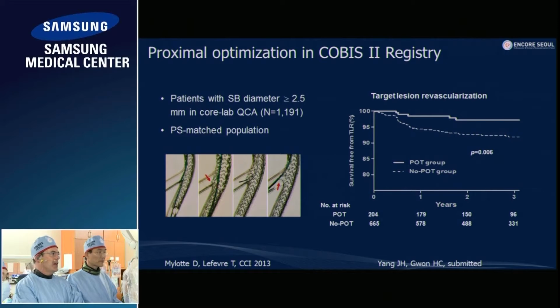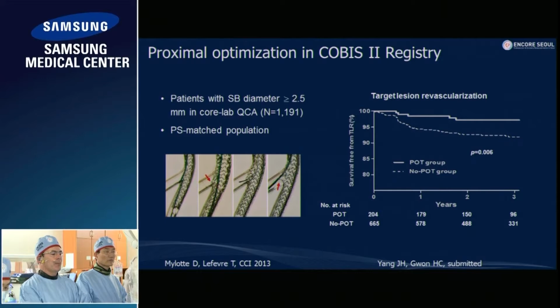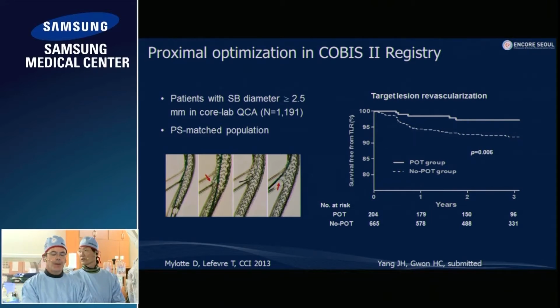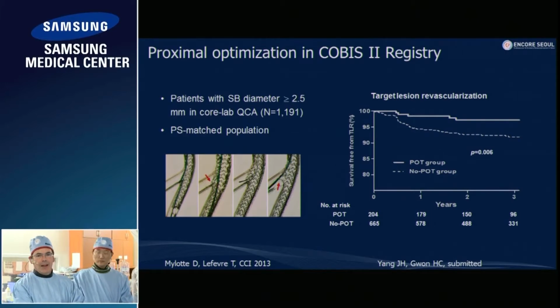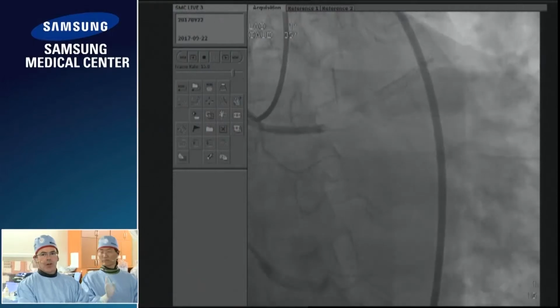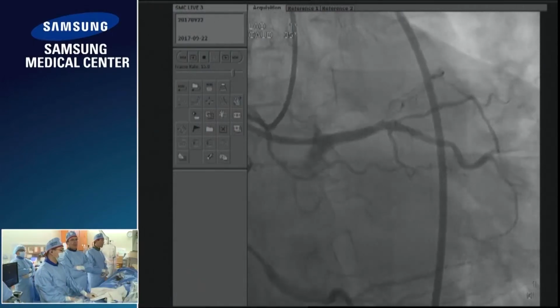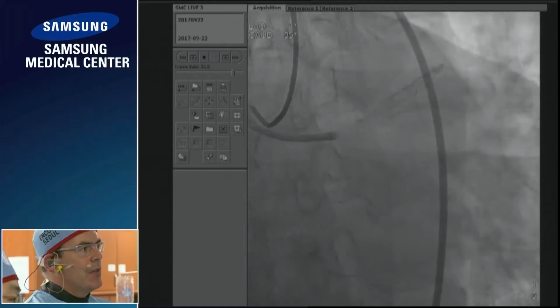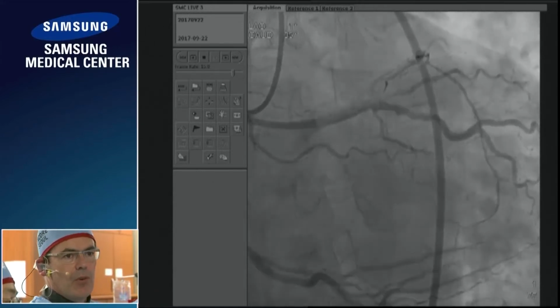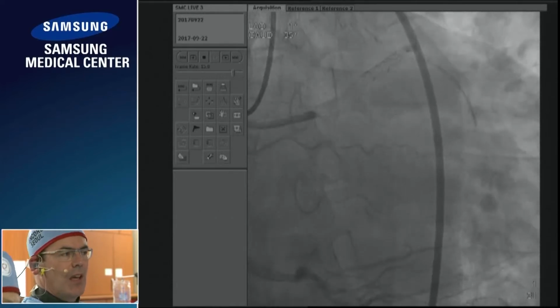Seeing this case, I think it presents a number of challenges. The entry into the CTO here, I think, was unambiguous. So we weren't facing the challenge of an ambiguous cap, such as left main LAD flush occlusion, which really is, I think, one of the most challenging situations. You've got an unambiguous cap and entry into the CTO segment. So it's a relatively short segment, and yes, there's good retrograde filling, but this is a primary antegrade wire escalation case.